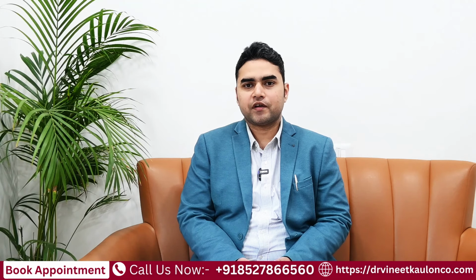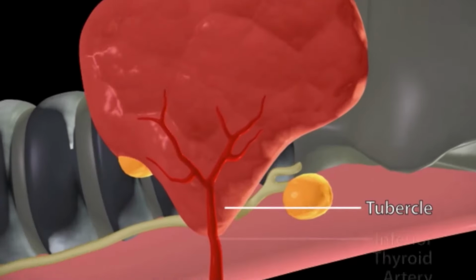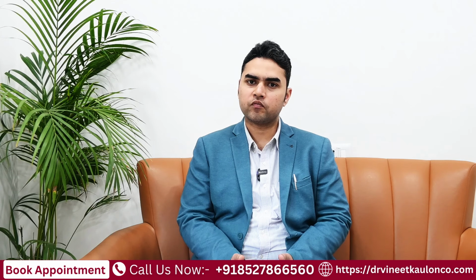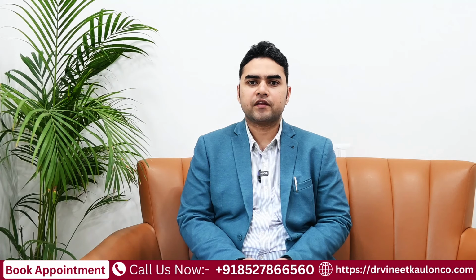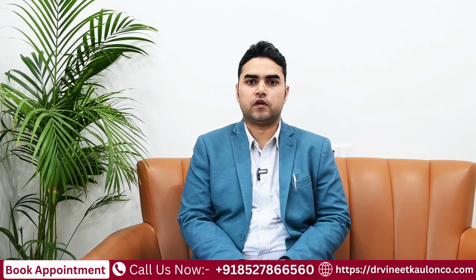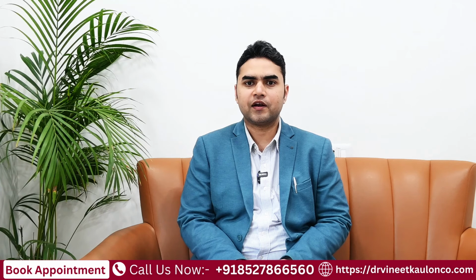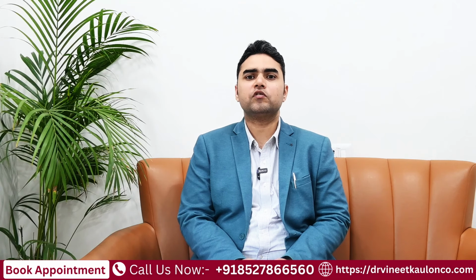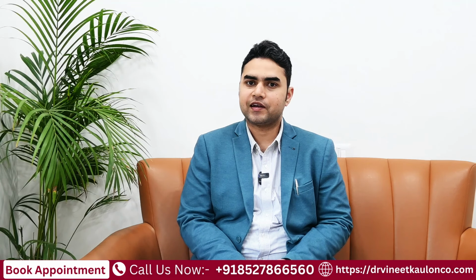So, robotic thyroidectomy or parathyroidectomy means using the surgical robot to remove part or whole of the thyroid gland and the parathyroid gland. The function of the thyroid gland is hormone production, thyroxine production in your body, and sometimes that can get deranged, or some tumors may form in your thyroid gland, and that may need to be removed surgically. Parathyroidectomy is done when one or more of the parathyroid glands enlarge in size and start producing more parathyroid hormone. This leads to calcium imbalance in your body and can be cured by removing the affected parathyroid glands.